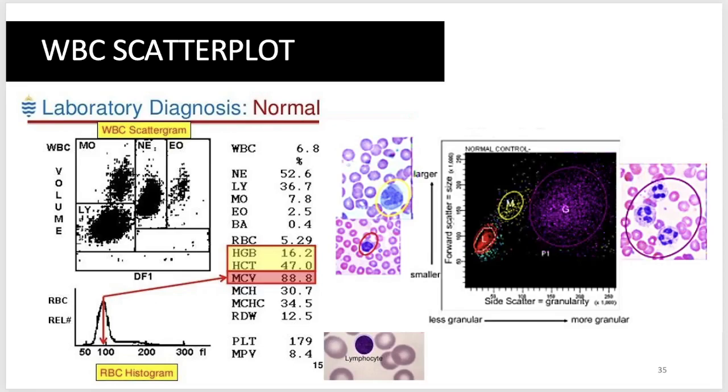Ironic, no? Doctor na ako, gumraduate na ako ng medtech, doctor na ako, pero ngayon ko pa lang naintindihan yung mga different na histogram, yung mga scatter plot. Usually, nakikita ko lang talaga, medtech ako dati, nag-duty ako. Nakikita ko lang to, and hindi ko siya na-interpret. Kasi technically, dito lang talaga ako sa data tumitingin ng result. Pero no, that's the importance, it's the visual.